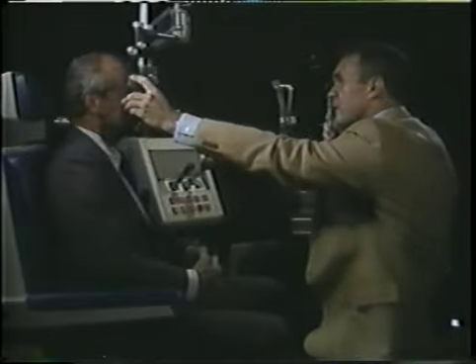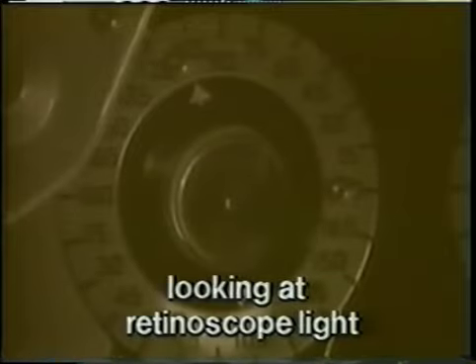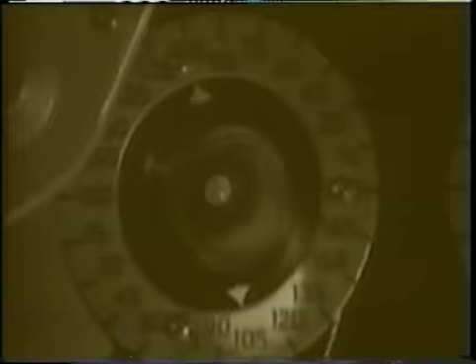Before finishing, Dr. Guyton will take a look at common problems with the retinoscopic reflex and will discuss what to do in each case. Here we are retinoscoping a patient without drops, and suddenly the pupil constricts and the reflex changes. What happened? The patient looked directly at the retinoscope light. Redirect his attention to the end of the room. That's better.